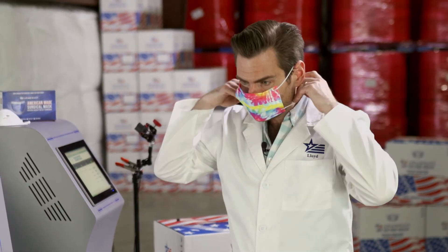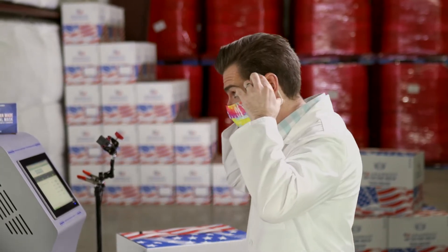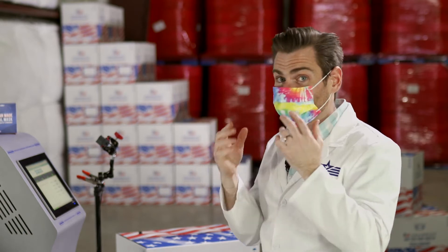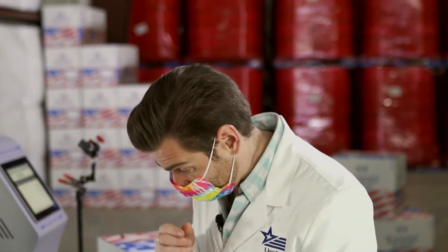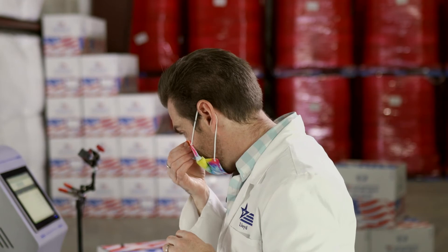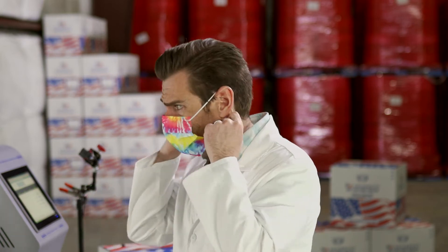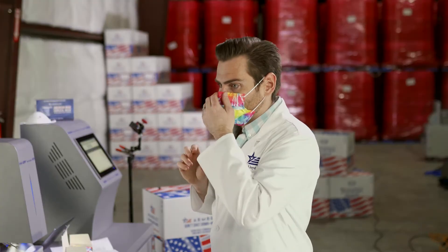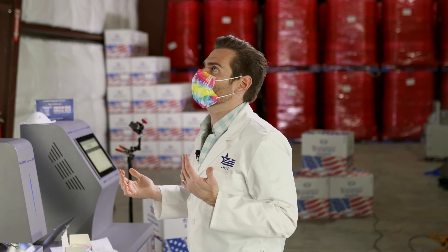I'm going to go ahead and test this and put it on real quick. Okay, the ear loops are way too big — we saw that with their kids masks too. The reason that matters is look at how this is just falling off my face — I don't like that at all. The ear loops are very comfortable and stretchy, but on breathability the other We Care mask is better, and these ear loops are just too big.